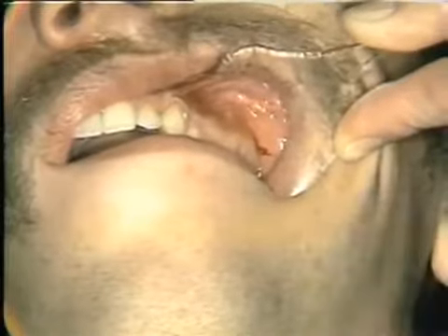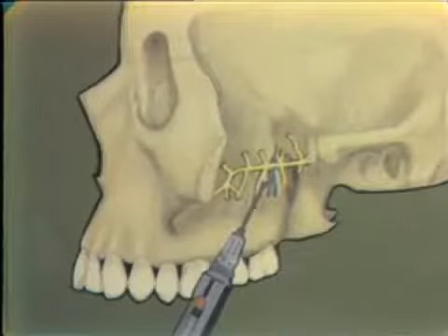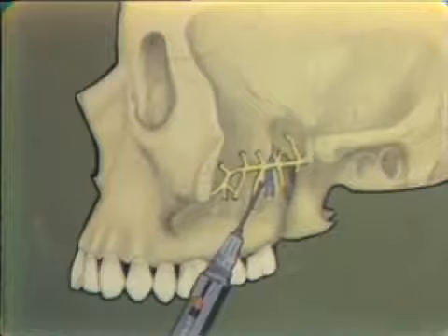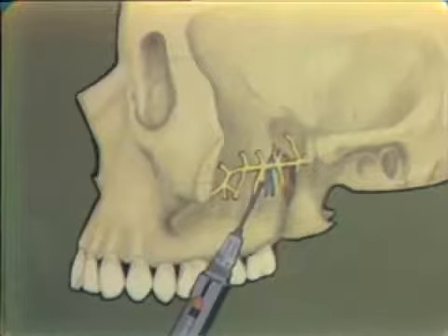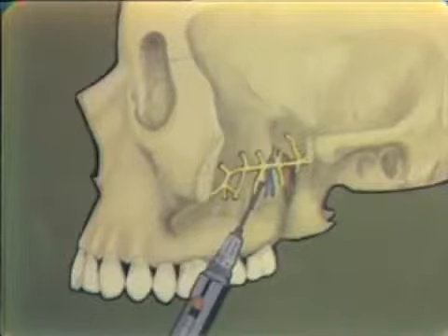The posterior superior alveolar injection is a distinct advantage. We'll let Andy close here for just a moment. A distinct advantage where that malar strut lies over either the first or the second molar, and you anticipate instrumentation on that tooth, and it just affords too much of a barrier for a buccal infiltration of that particular tooth to get through, or for the solution to diffuse through. There are occasions when the posterior superior alveolar block is needed to afford good anesthesia of either the first and/or the second molar, depending upon the site of the malar strut in relationship to the particular tooth.